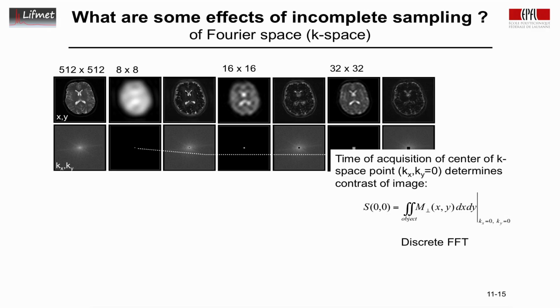If we look at the discrete Fourier transformation, we employ the fact that it is periodic over the sample time period, and we can do a time shift. So here's the signal, that's the echo that we record. In discrete Fourier transformation, this signal is going to be the same signal in magnitude as this signal.